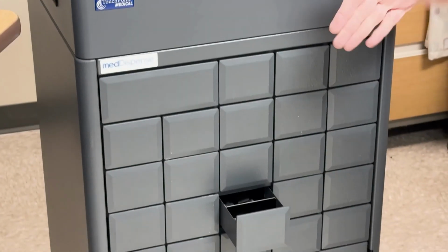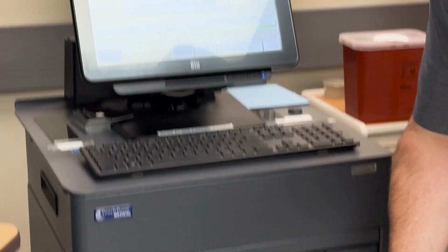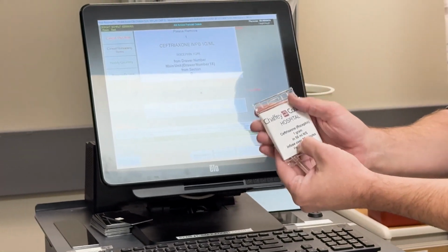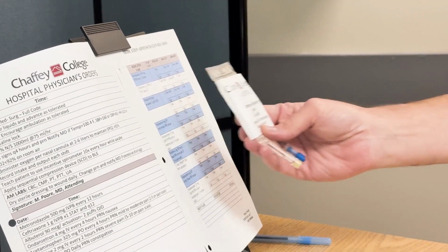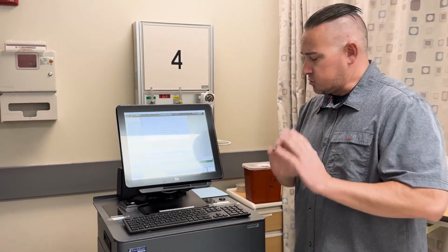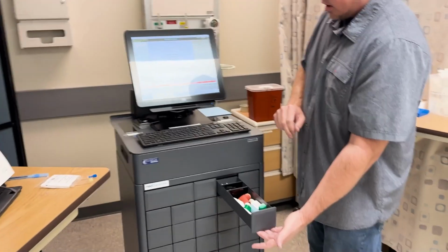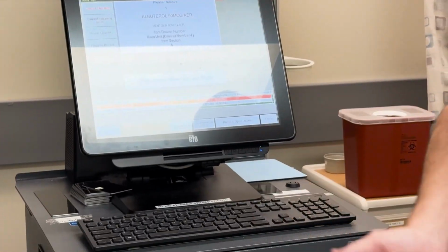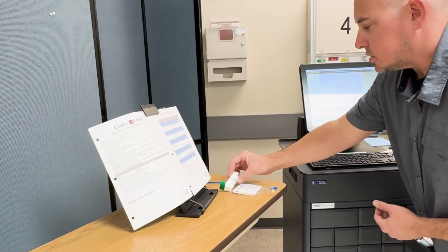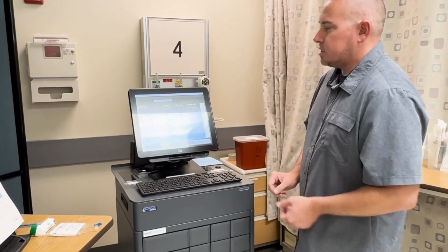Press to open drawer. Magically, the drawer is going to open. It tells you that ceftriaxone is in section D. A, B, C, D. Hey, look at there. Ceftriaxone, 1 gram. Matching it up. Yep, that's what I needed. Again, doing however many med checks, rights, and verifications there are. By the time you guys graduate, they always seem to be adding more. Pressing here to access the next item. Now it's telling me the albuterol is in section A. Section A, here's my albuterol. Again, verifying everything is correct. Pressing here when you are done brings you back to the main screen.